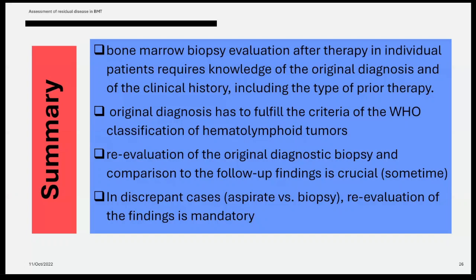Sometimes when assessing post-chemo cases it is important. In discrepant cases, aspirate versus biopsy, re-evaluation of findings is mandatory. I think that's all.